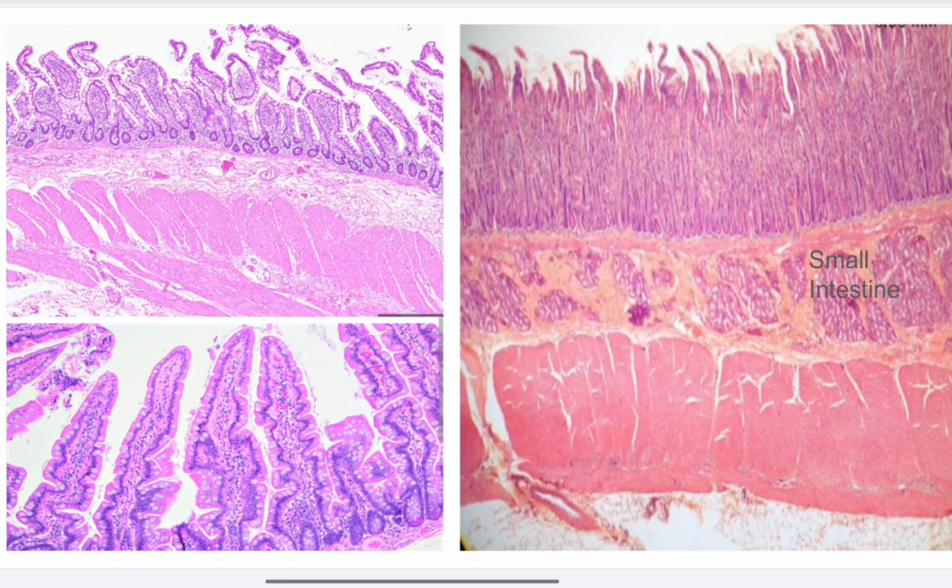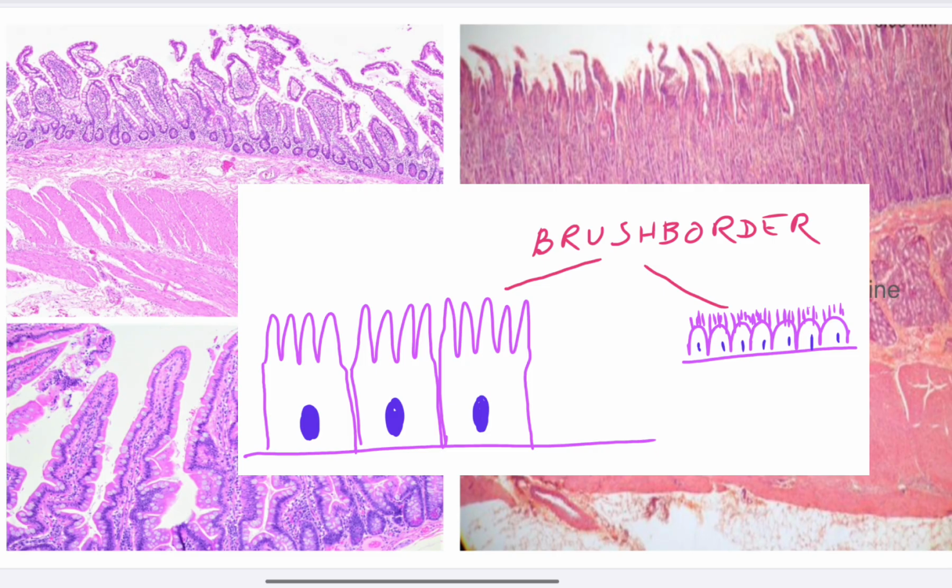The upper or luminal border of the surface cells of the simple columnar epithelium has a luminal aspect of the cell membrane. It takes many foldings projecting into the lumen, and these foldings give rise to microvilli.